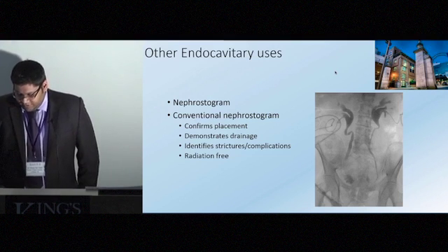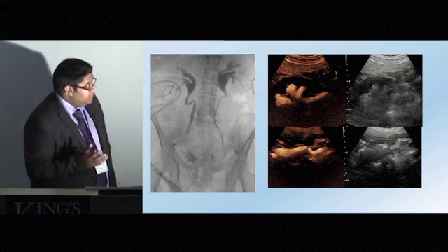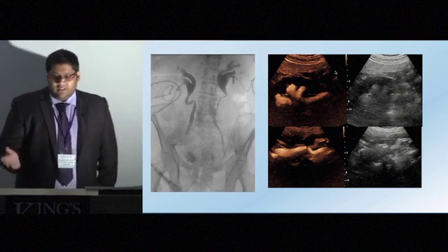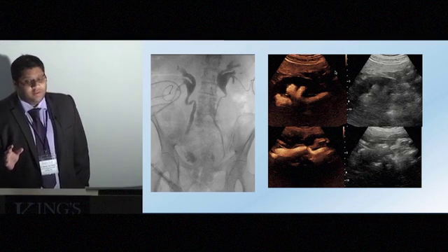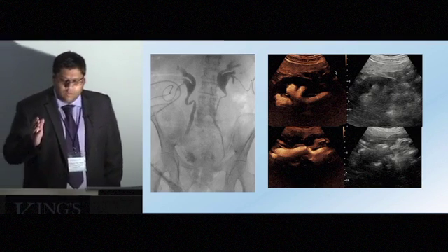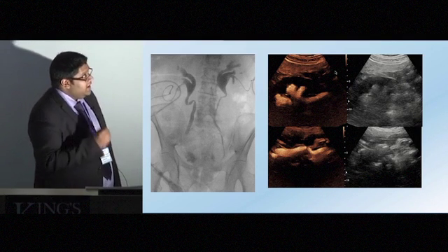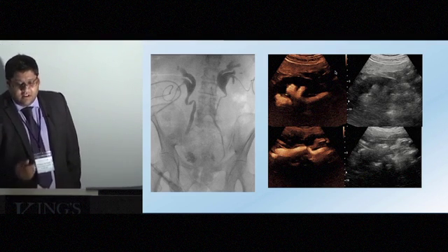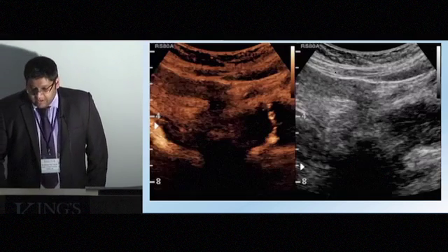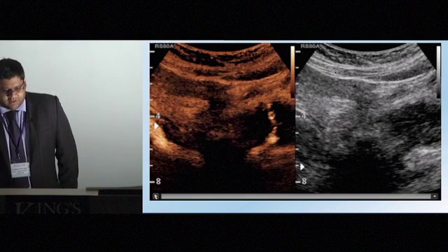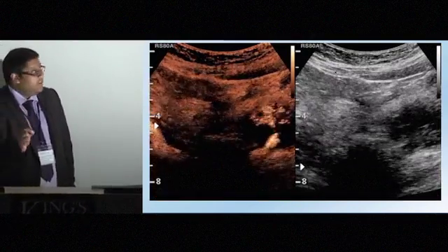In addition, it has the benefit of being radiation-free. Here's a patient with bilateral nephrostomies. On the left side you can see drainage along the collecting system; there are two fibroids in the pelvis but no contrast within the bladder. With the contrast ultrasound delivered through the nephrostomy tube, you can see excellent opacification of the calyces and the ureter clearly defined along its length.